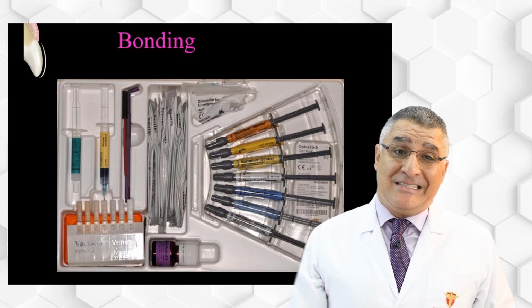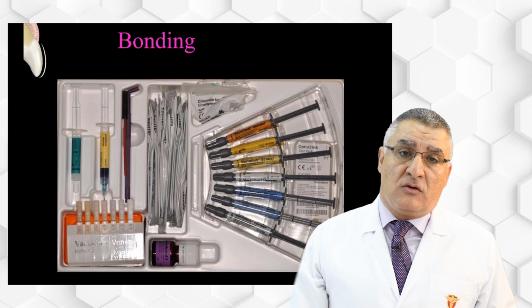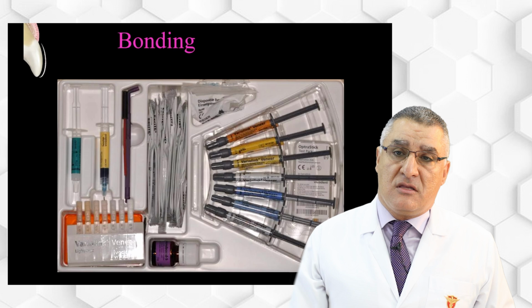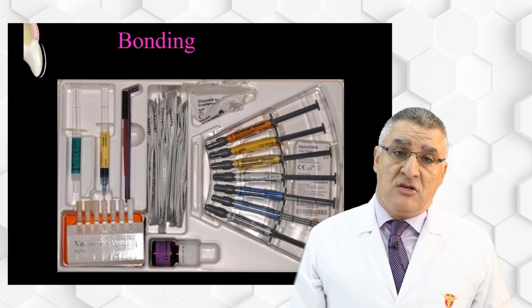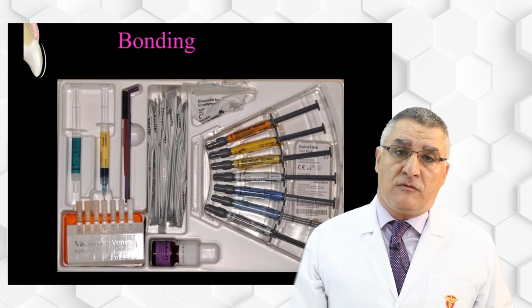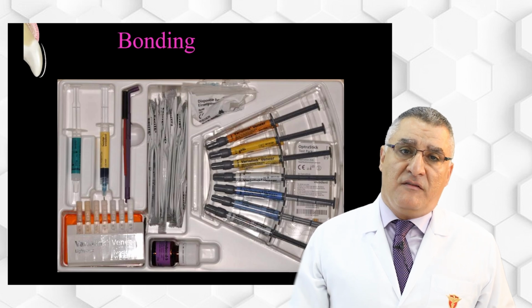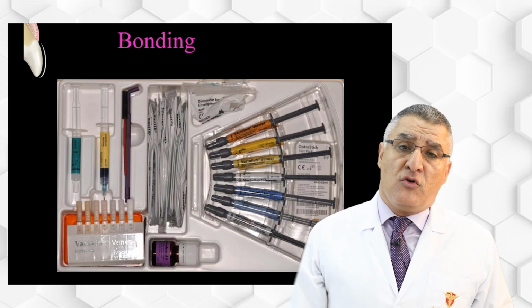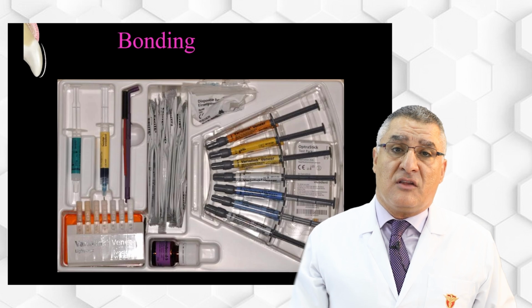So we have to use a resin cement. Usually they are supplied in different shades, either Vita shades A1, A2, A3, or some manufacturers supply opaque, translucent, and dentin shades. So we have to check which resin to be used for cementation or bonding of the veneer by using the try-in paste. Every resin cement has its corresponding try-in paste. So before your cementation, you have to check the final shade of the restoration using the try-in shades.